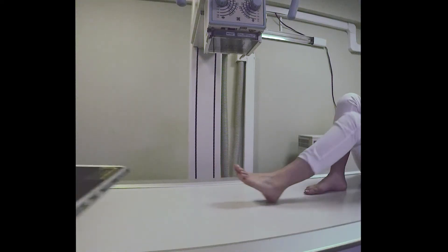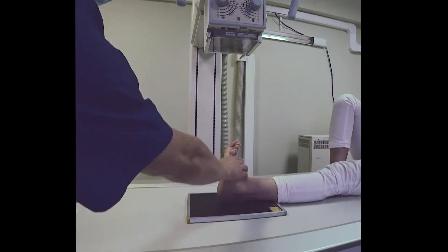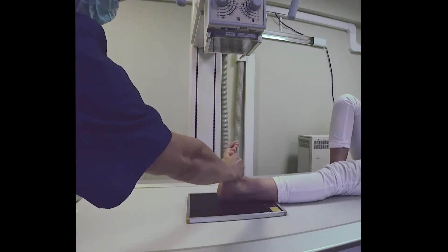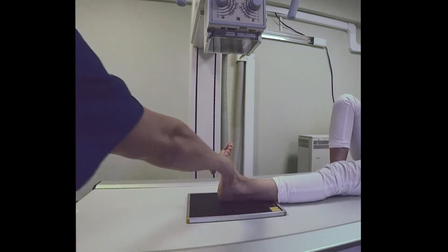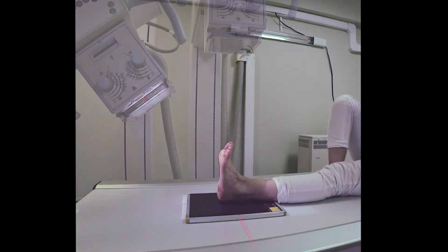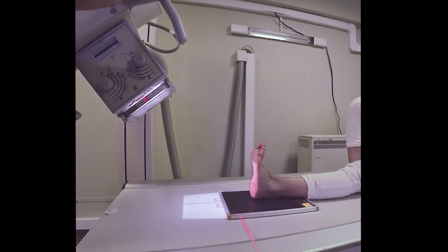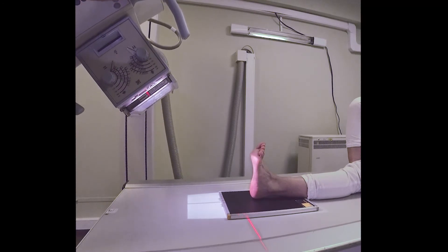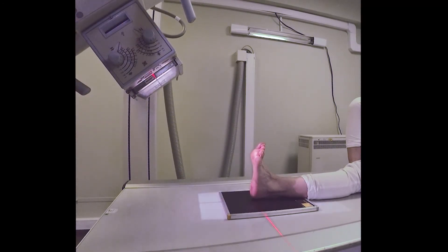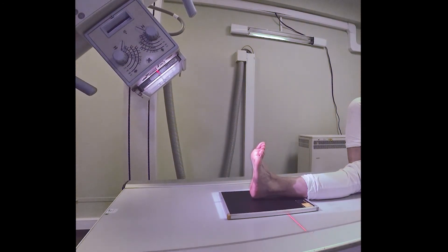To get an axial view of the calcaneus, the patient has to be in supine position. The foot should be flexed at 90 degrees to the shin, and the x-rays should be directed at 45 degrees to the horizontal plane, aimed at the plantar side of the foot at a point between the middle and posterior thirds.